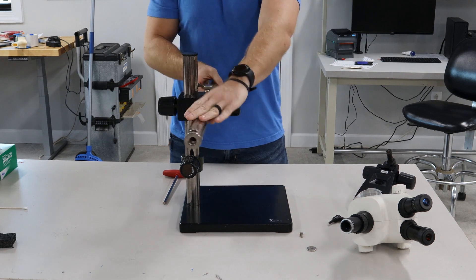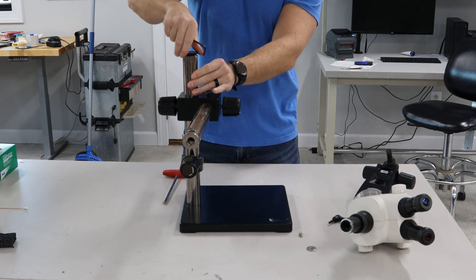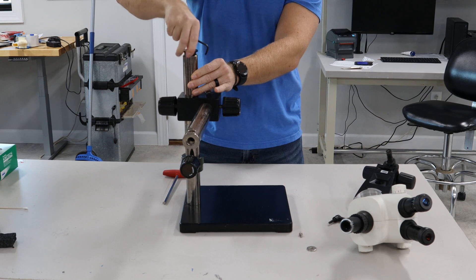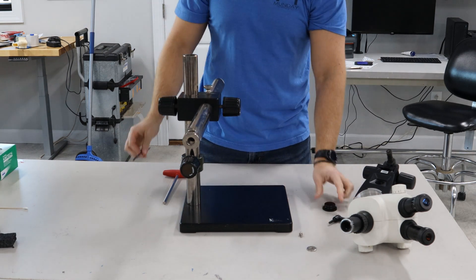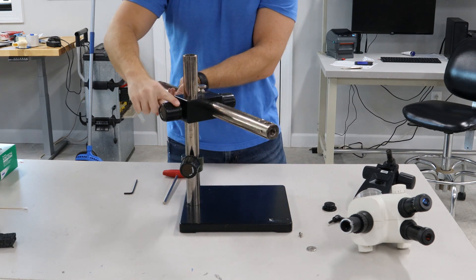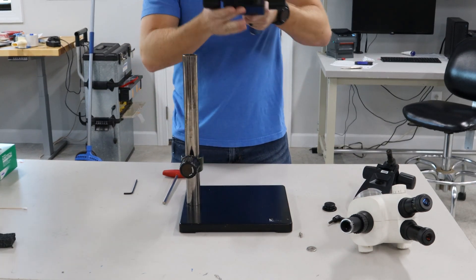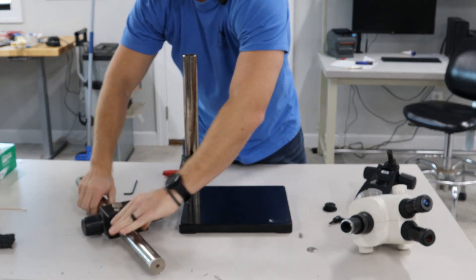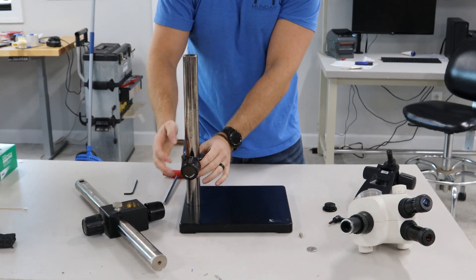From there you're gonna remove this runaway collar. Once you remove that, you're gonna take this knob right here, loosen it, and the whole assembly will come off. Set that to the side and then you have another runaway collar here.